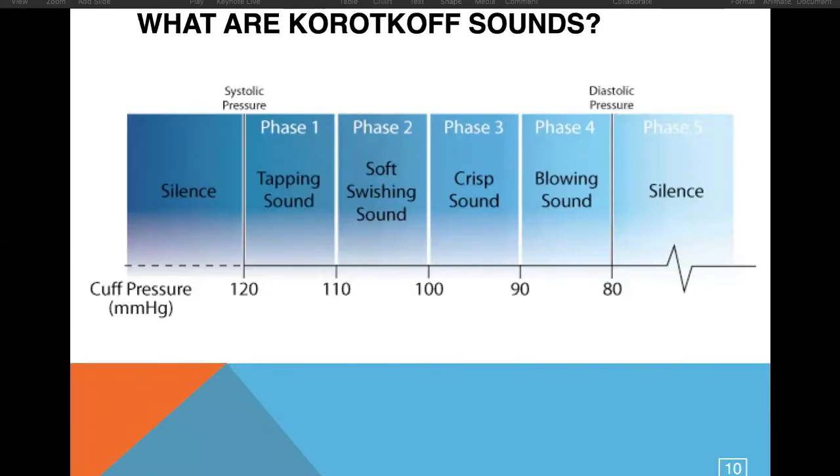But then as we release more water, it becomes a more gentle flow, and the sounds of that rushing blood become less and less until there's no real pressure behind it from that dam anymore. And then we're just going to hear the pulse of the heart. And then as it becomes a more laminar flow, or smooth flow, we won't hear those sounds of pressure anymore.